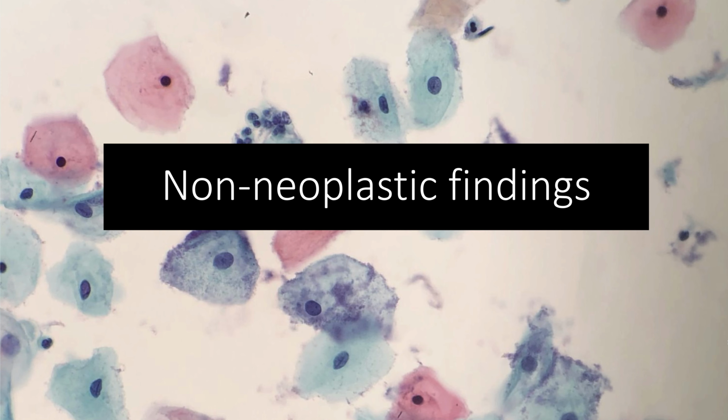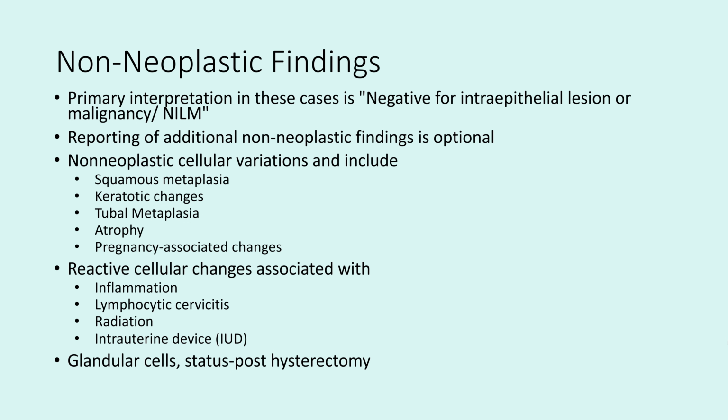So now we'll move on to non-neoplastic findings. The key thing to note is that the reason that we do Pap smears as pathologists is to screen for squamous cell carcinoma of the cervix and its precursors. So the first thing you want to tell the clinician always is that it's negative for an intraepithelial lesion. And then the reporting of all of these non-neoplastic findings is optional, and it's also not the reason why Pap smears are done. So we do it to report changes, to help management. And we want to make sure if you see something, you report it.